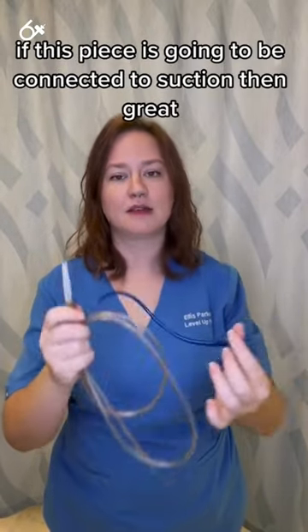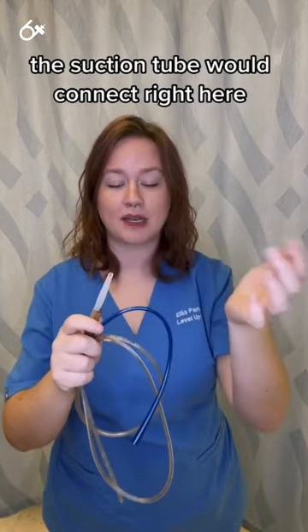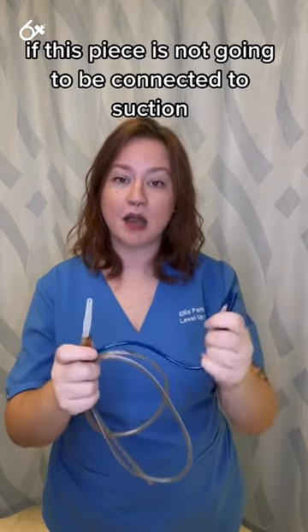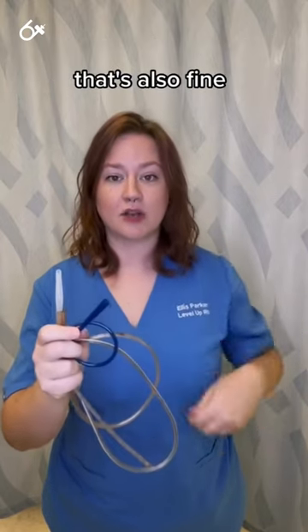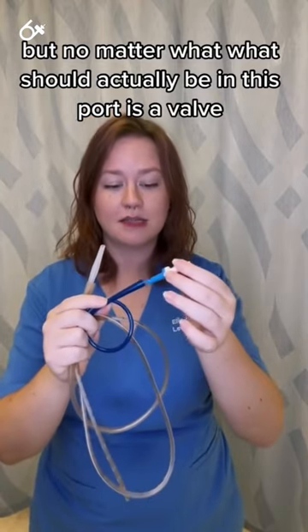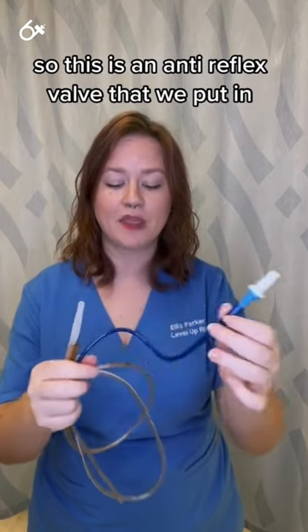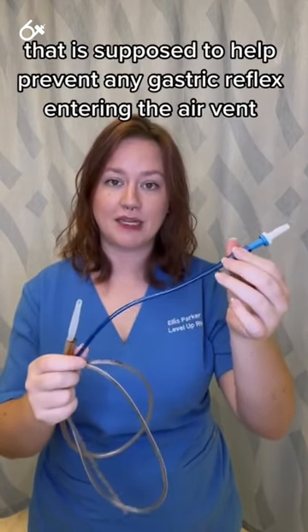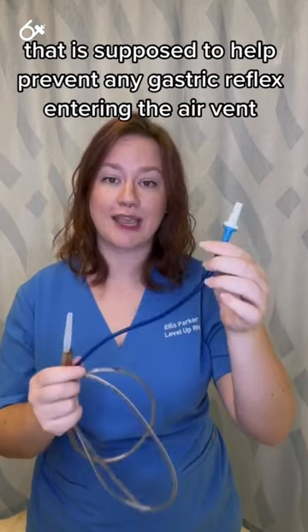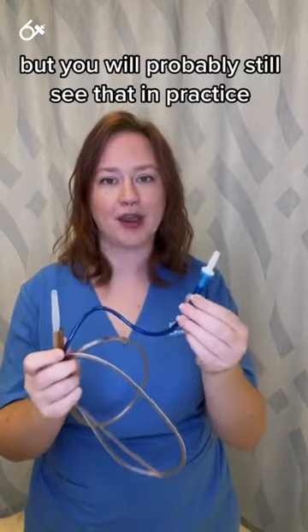If this piece is going to be connected to suction, then the suction tube would connect right here. If it's not going to be connected to suction, that's also fine, but no matter what, what should actually be in this port is a valve — an anti-reflux valve — that is supposed to help prevent any gastric reflux from entering the air vent. They really aren't supposed to be connected like that, but you will probably still see it in practice.